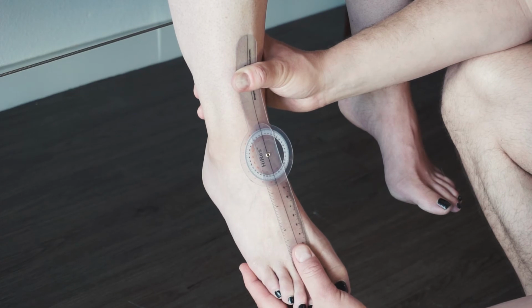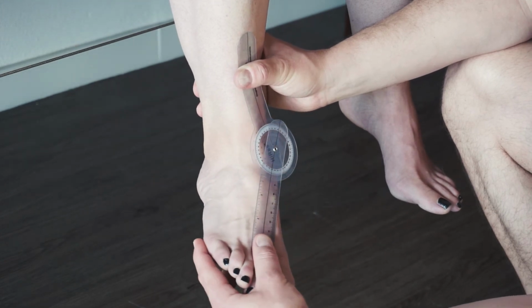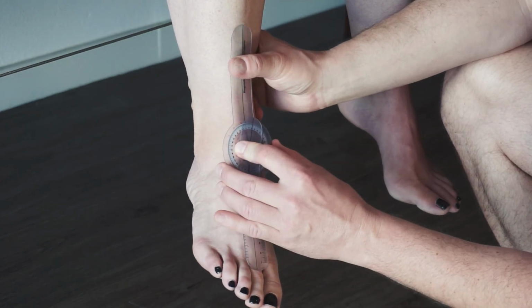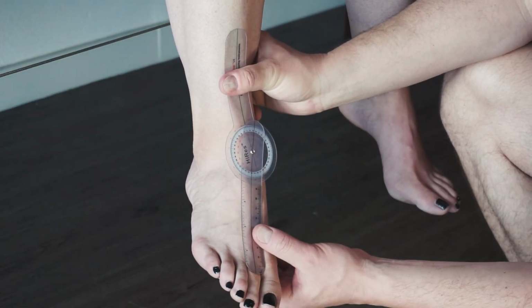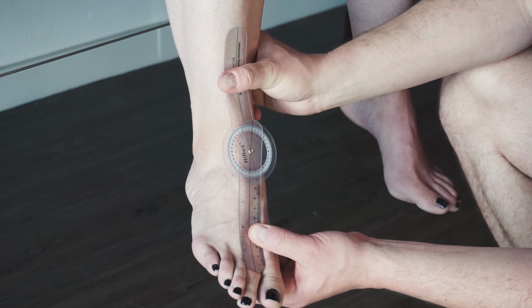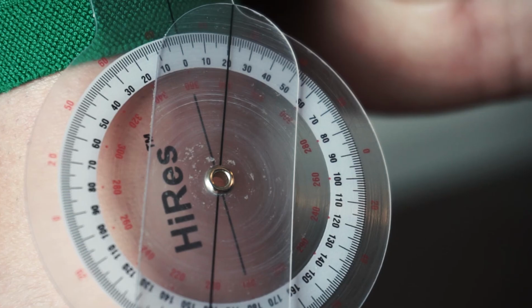Now I'm going to have her evert, so she's going to evert. And she has a ton, and if you got to move things back, make sure that axis and everything's lined back up. There's nothing wrong if you got to reline things up. So as you can see here, she has 20 degrees of active eversion.